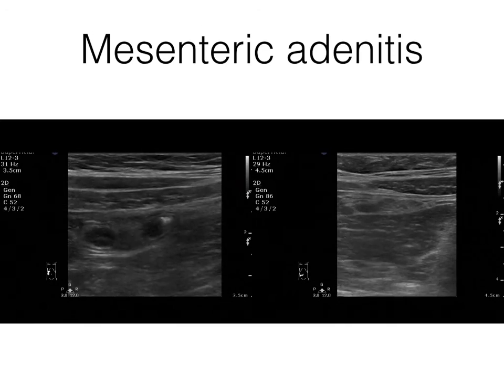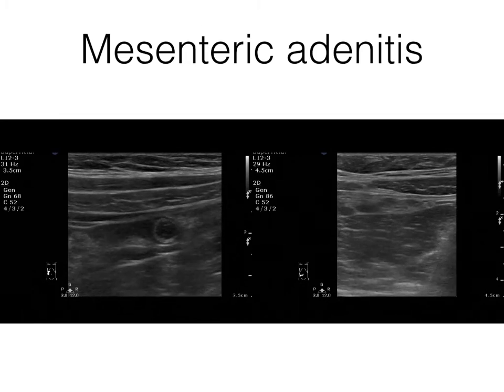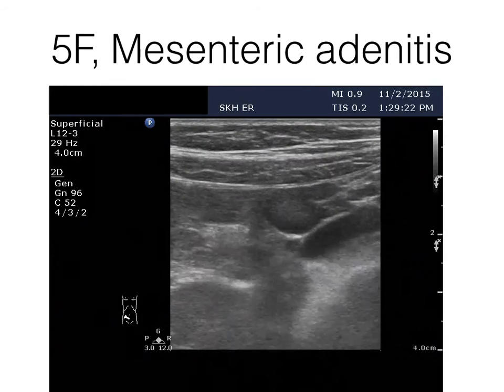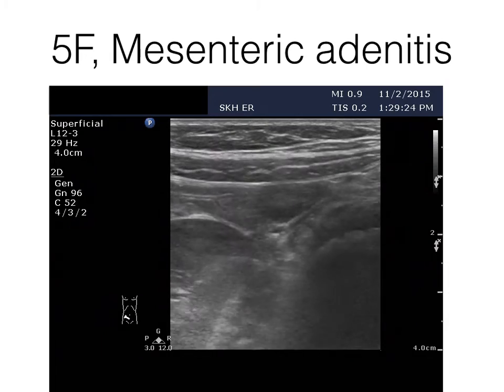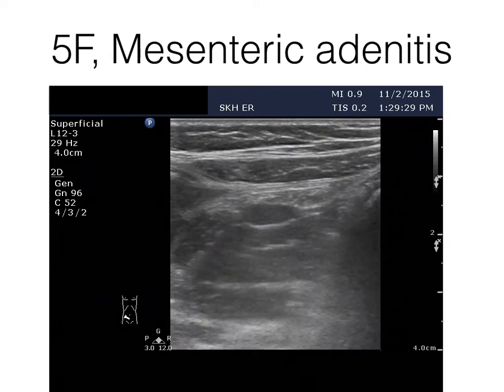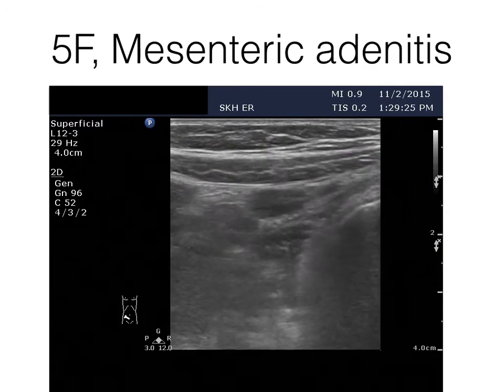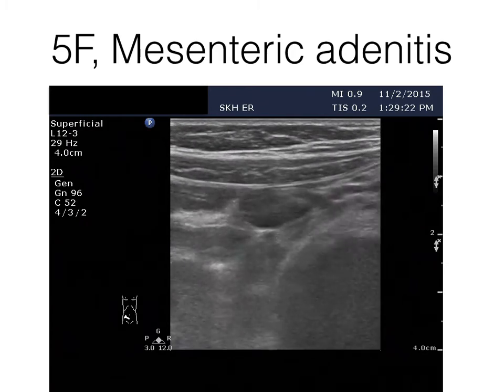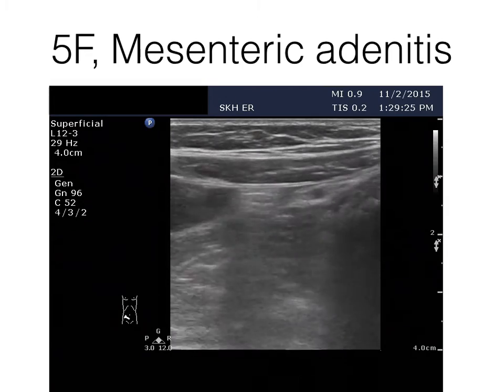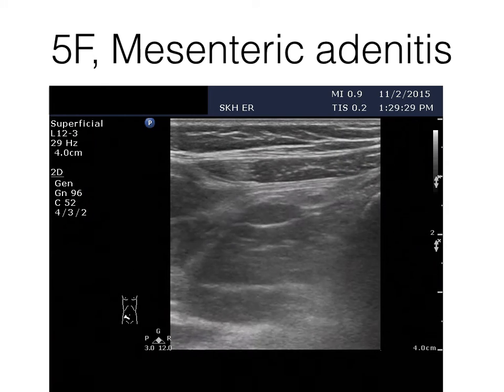That is a reactive reaction, not actually appendicitis, because the structure around the appendix is quite clear compared to the hyperechoic mesenteric fat in the previous videos. A 5-year-old girl also has right abdominal pain. We can see this solitary lymph node. So how do we distinguish a lymph node from vessels without Doppler? You just scan along the path. The vessels you can track, but the lymph node appears solitary. So the lymph node is here, and the other one is the upper one.